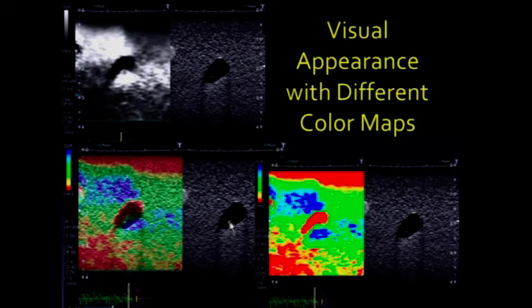Again, you have to be aware of this and standardize things in your lab and be aware of other people, because if you look here where we have the trilaminate color pattern, red, green, blue, I think it's much easier to pick up in this view than in this view. So be aware of that.